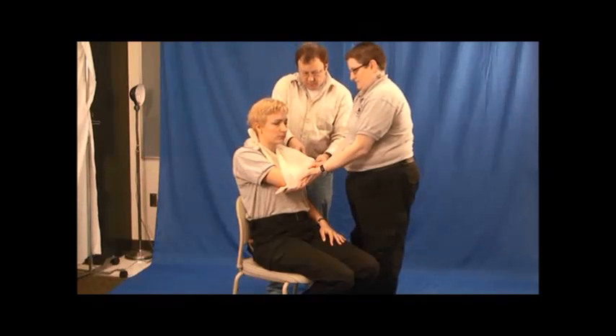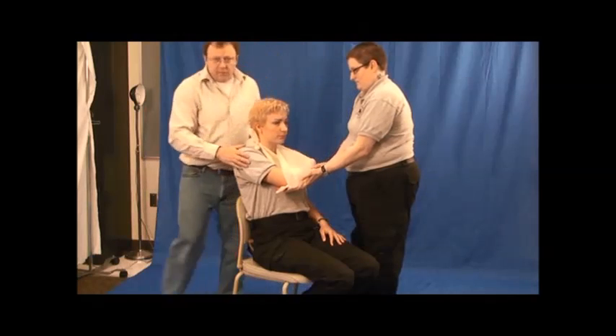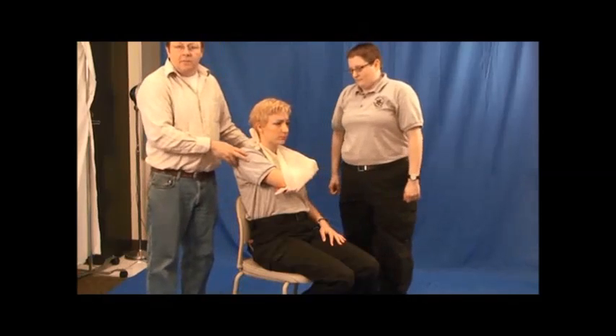Check for pulse, motor — with your fingers — and sensory — can you feel this? Yes. And this is how you stabilize a forearm fracture.